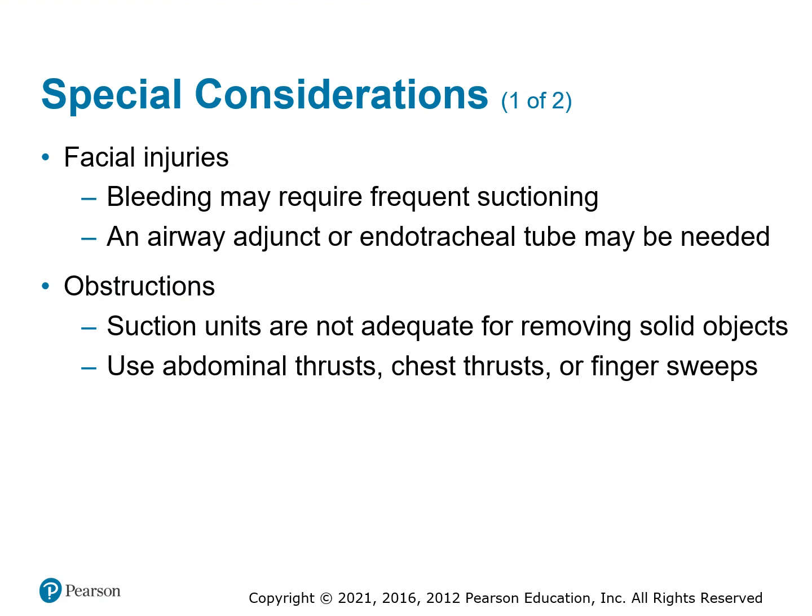Special considerations. Facial injuries could include bleeding in the airway. It could make it difficult to put a bag on. It might be difficult to move a jaw to be able to put an OPA in or even a supraglottic airway. There could be obstructions. You might not be able to get some of the solid objects out.